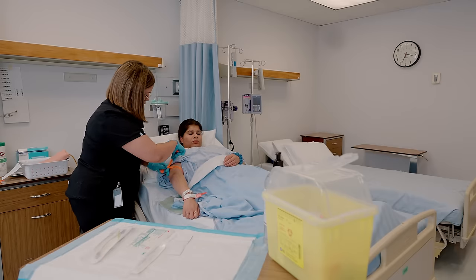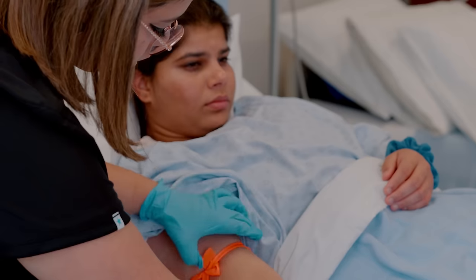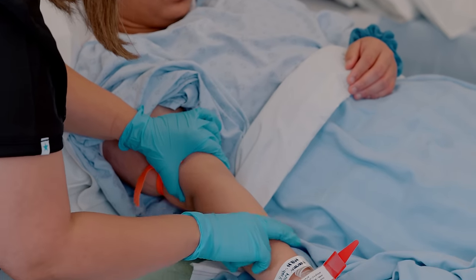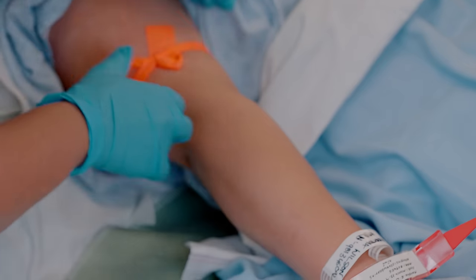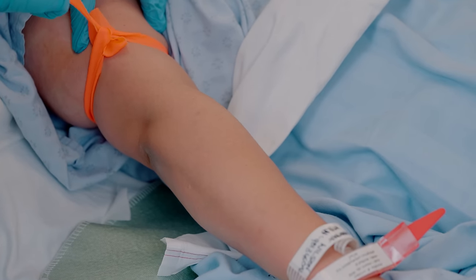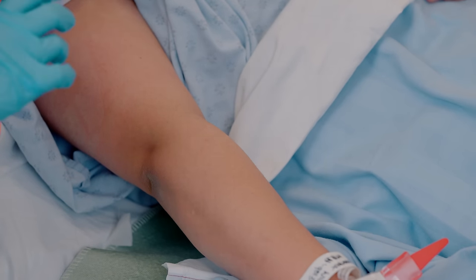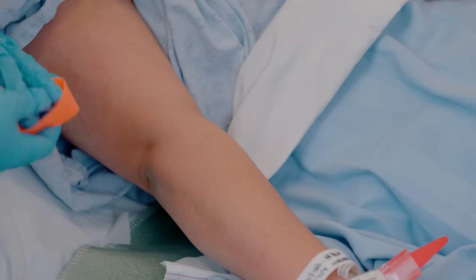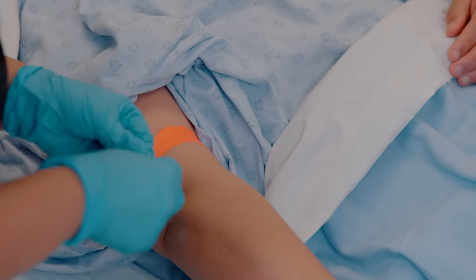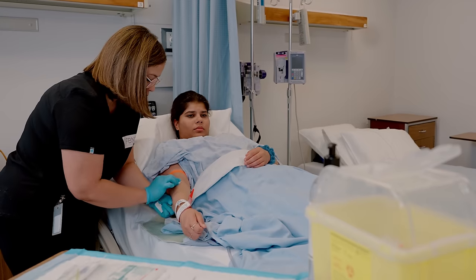For demonstration, tie the tourniquet to the arm, then assess the veins and see which insertion site looks the best. Once you have found your site, release the tourniquet because you do not want to obstruct blood flow for a longer period of time. Once you are ready, reapply the tourniquet and cleanse the site using an alcohol swab or chlorhexidine swab.